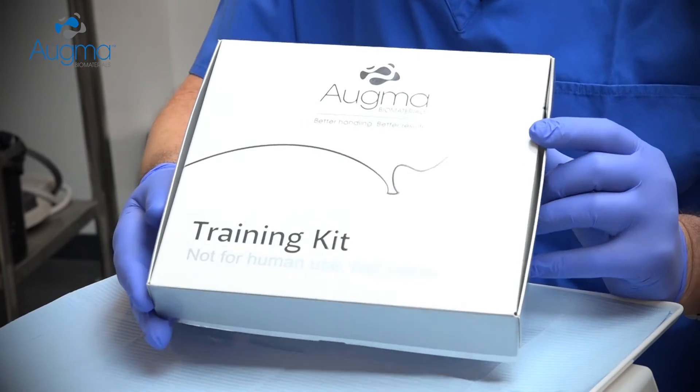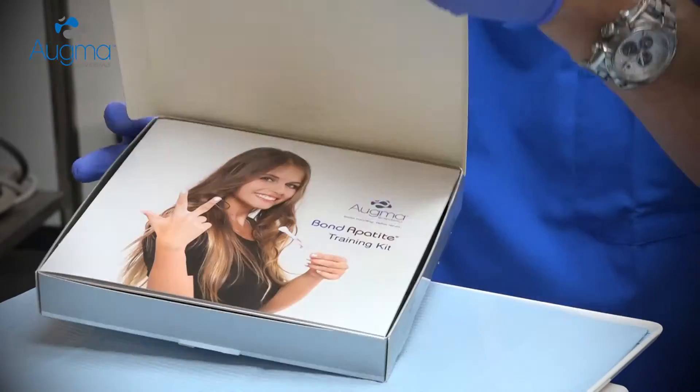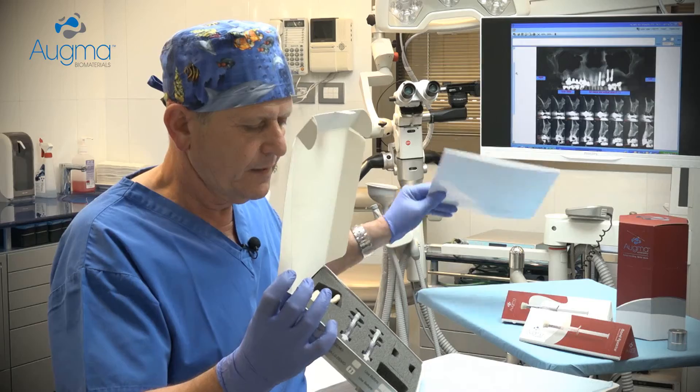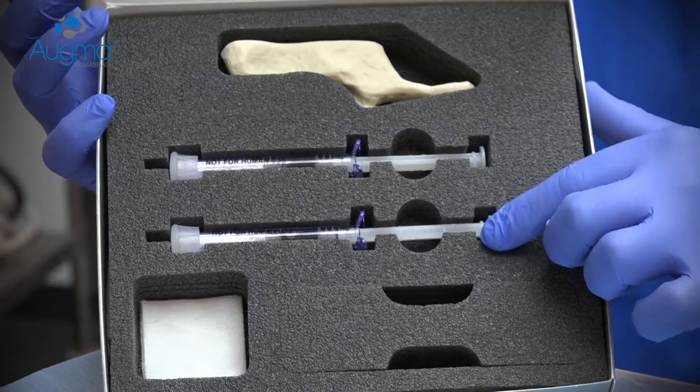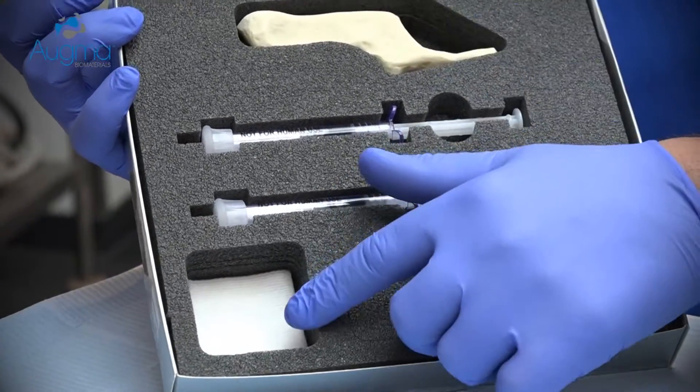In order to be familiar with the material, we provide you a training kit. The training kit includes a training manual, two demo syringes of Bond Apatite, a mandible, and a dry gauze.